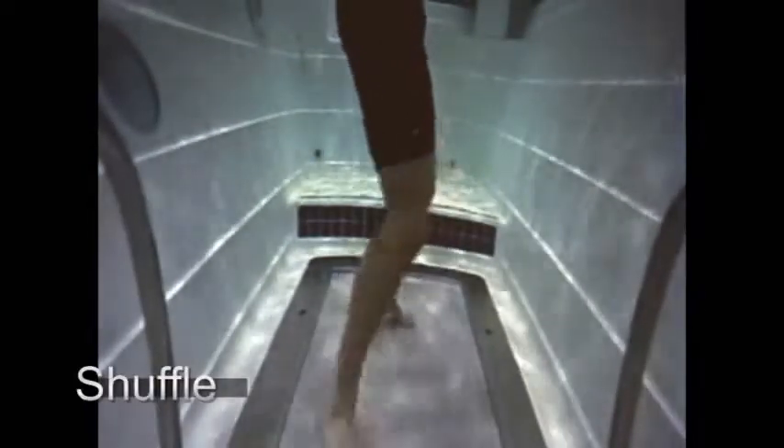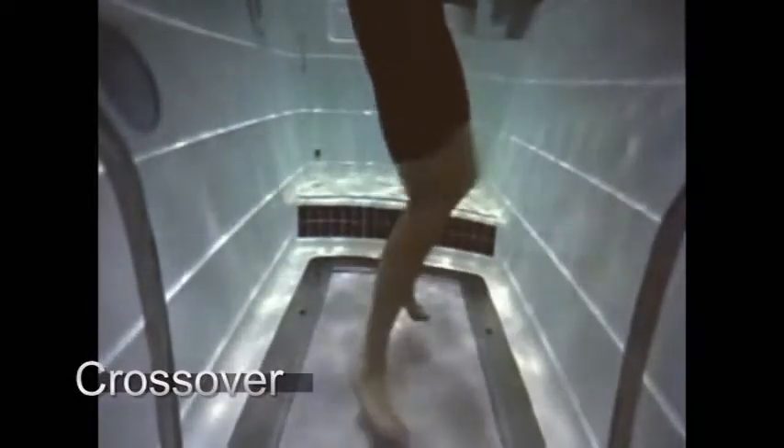As the tape goes on, I speed up the treadmill a little bit more and more, so it gets a little bit more intense. It's more ballistic — more of a hopping shuffle, that type of thing, adductors. Working on the crossover, same thing, just adding a little bit more difficulty to it, a little bit more range of motion possibly.